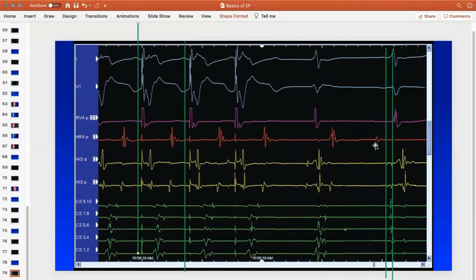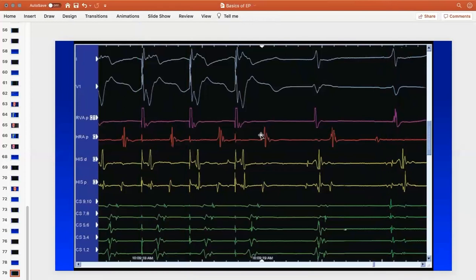And then, like here, you have a sinus beat, with normal conduction. So it's normal conduction, but you don't want to get carried away. You just start by breaking it down into pieces. And you did very well. But when you see this, you're wondering, could this actually conduct to this or not?